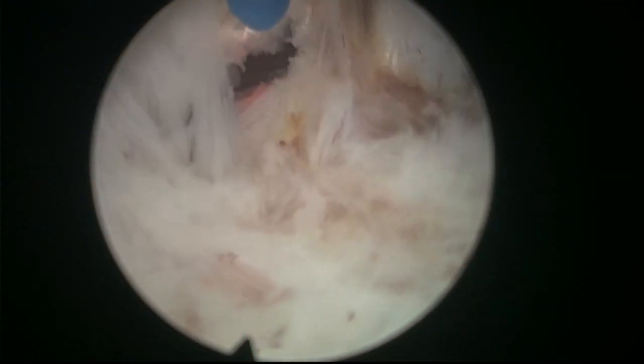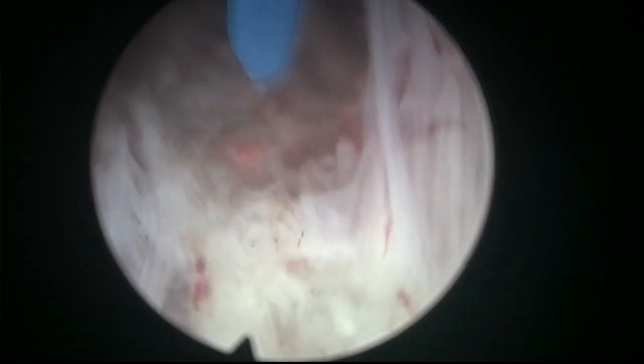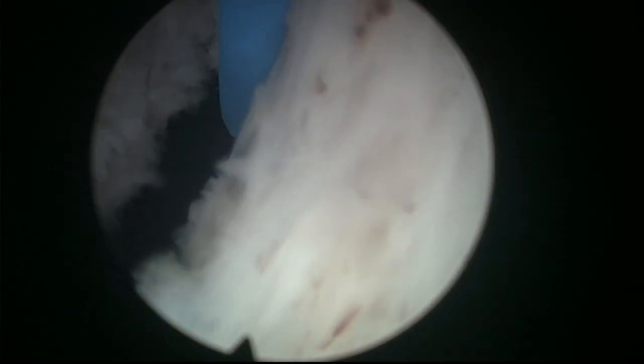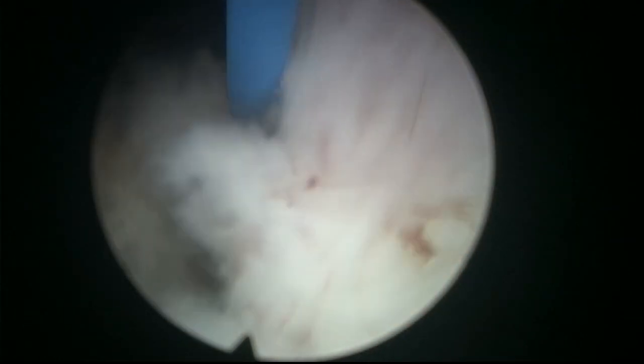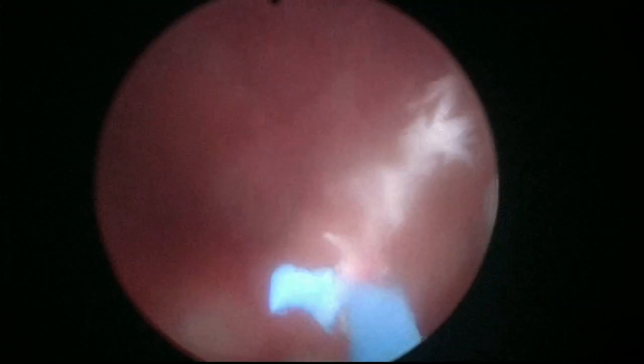We are completing the dissection of the lateral lobe. The lateral lobe is pushing forward — we are getting to see the bladder neck, and I can go all around the bladder neck, coming up towards the limit. Really a piece of cake operation, I think. For those of you who don't do HoLEP yet, I would say there's nothing so rewarding as to do HoLEP — the patients are super happy. These are the happiest patients I see. So the enucleation is finished. There's still a small bridge — my water inflow came out, that's why the visibility changed.